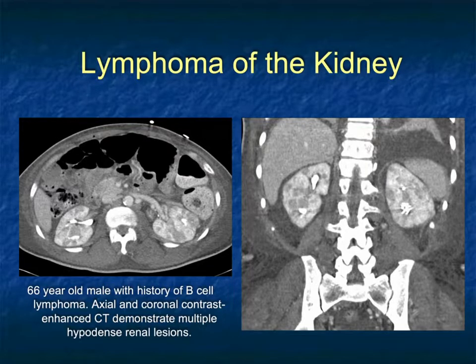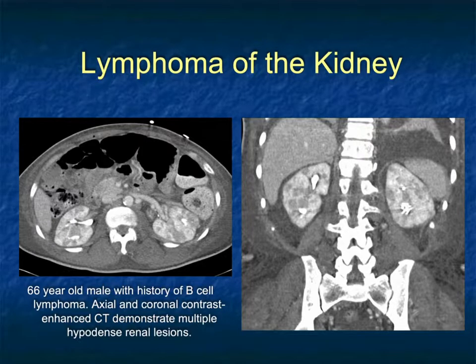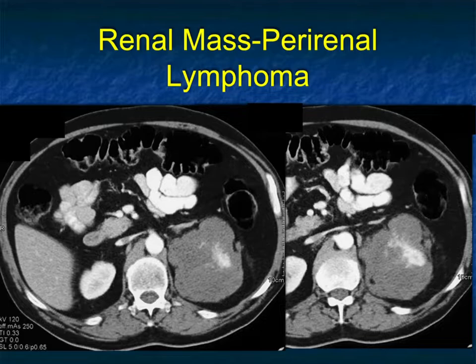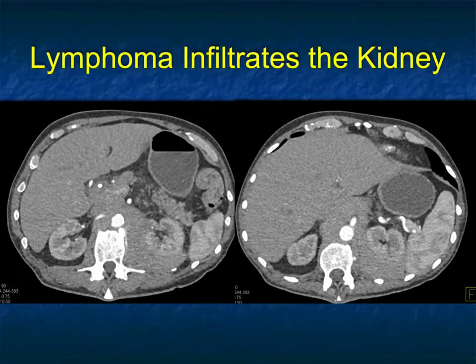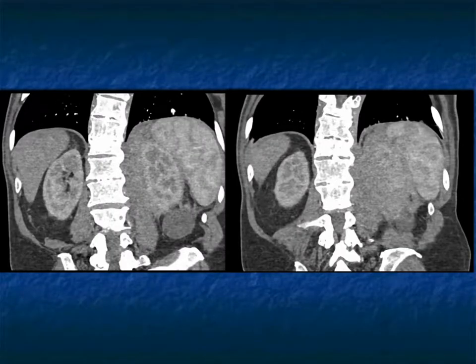Lymphoma does not always enlarge the kidney. Here's an example with multiple hypodense lesions infiltrating the entire kidney, yet the kidney is not really enlarged. Another example of perirenal space involvement: renal cell is not going to look like this, TCC is not going to look like this, metastases are not going to look like this — this is classic lymphoma with perirenal space involvement. Here's another example: infiltration of the kidney, perirenal space, and extensive periaortic adenopathy — B cell lymphoma — with the coronal view showing the full extent of involvement.